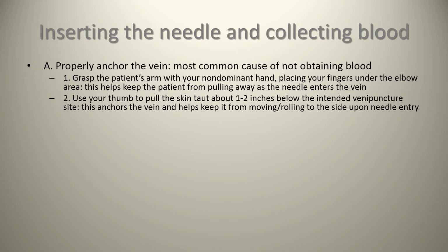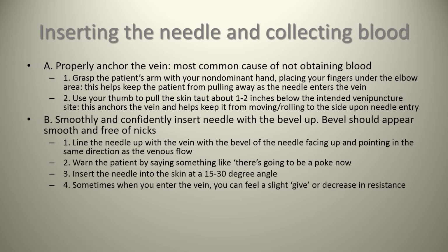Smoothly and confidently insert the needle with the bevel up. The bevel should appear smooth and free of nicks. Line the needle up with the vein, with the bevel of the needle facing up and pointing in the same direction as the venous flow. Warn the patient by saying something like, "There's going to be a poke now." Insert the needle into the skin at a 15 to 30 degree angle. Sometimes when you enter the vein, you can feel a slight give or a decrease in resistance, or a pop, as we like to describe it.